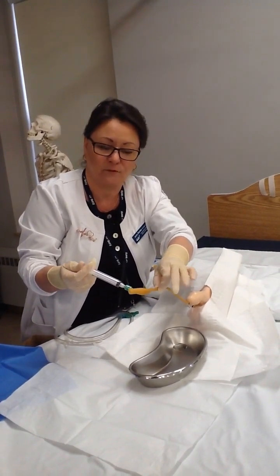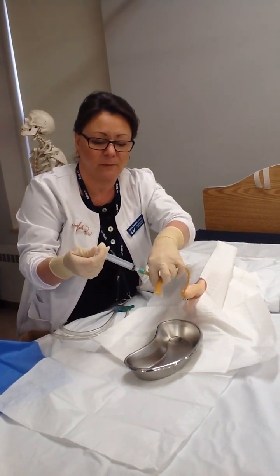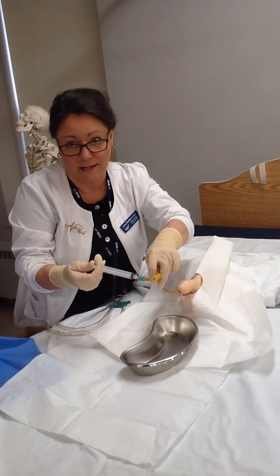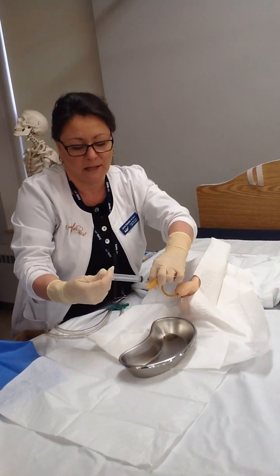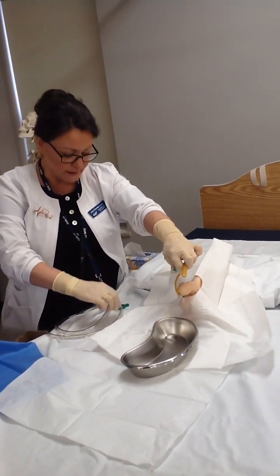And when I see that, I'm great. I'm just holding my thumb on the syringe. I'm bringing my fingers up. I'm pointing that catheter down because I'm going to connect the tubing to this sterile end so nothing can touch that. And I'm going to reach my thumb and my index finger up and pull that syringe off. And now I'm going to grab my tubing.